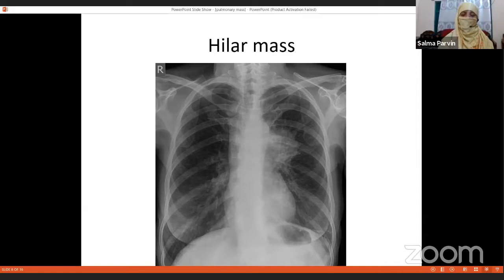Nothing is present in the chest X-ray, but there is a prominent hilum, and there is left recurrent laryngeal nerve palsy, which gives rise to hoarseness of voice. So what you should go for is a mass with local distortion, hilar involvement, mediastinal shifting, and the hemidiaphragmatic position.